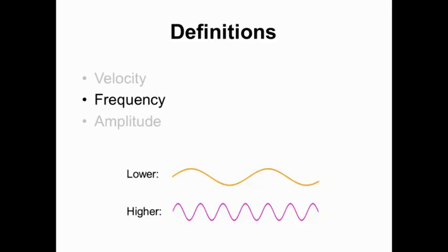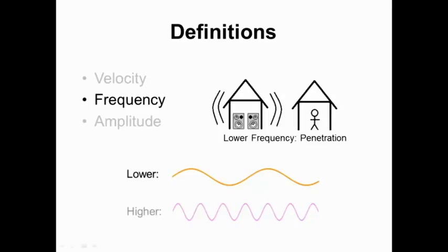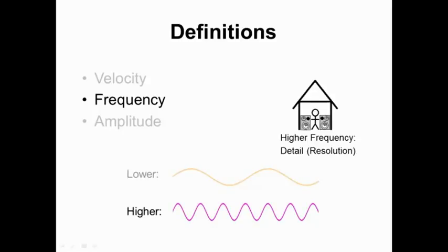An example that may help understand this concept is that of audible sound. Imagining a neighbor playing music, it's mostly the low frequency bass notes that penetrate the walls and travel distances well enough for you to hear. The high-frequency notes have lost their energy before they got to you, and while the bass notes are audible, the level of detail they contain is minimal. Now imagine sitting right in front of your speakers or wearing headphones. The level of detail is greatly increased by the high-frequency sounds which now have no trouble reaching you over the shorter distance.